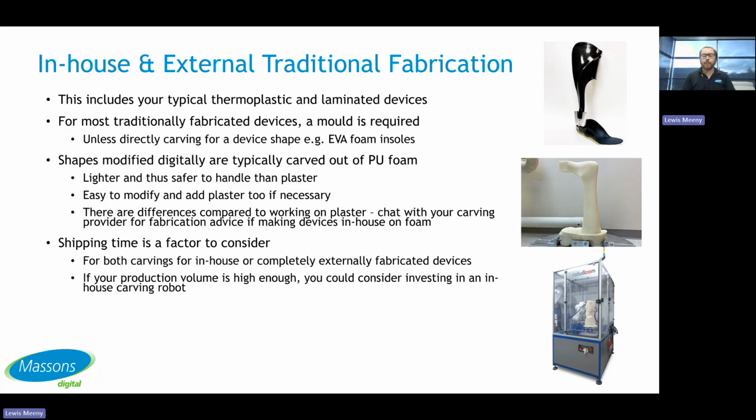But that being said as well, if your production volume is high enough and you're working purely in a digital workflow, that's when you can start considering investing in an in-house carving robot. So you no longer need to be waiting for somebody else to carve and ship, which even though that can be a turnaround of just a couple of days, if your volume's high enough, you can really start pumping out these molds and having all of that internally under the one roof.